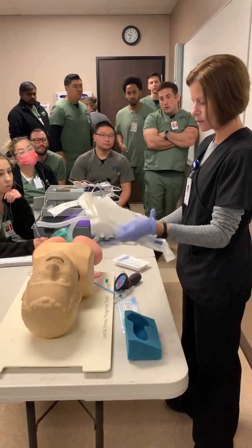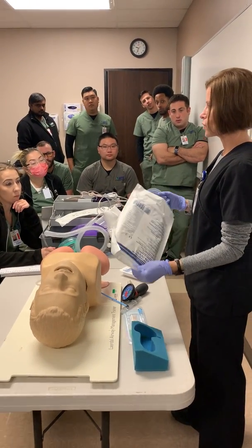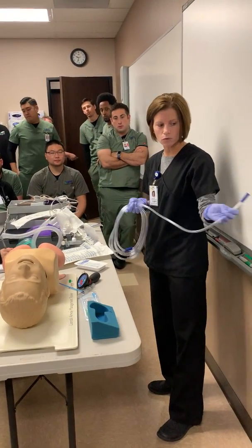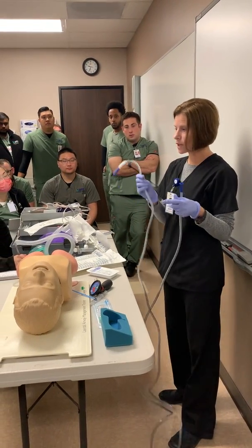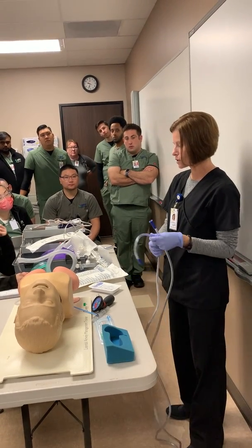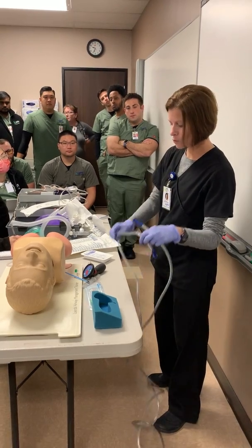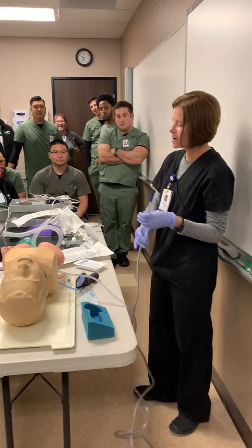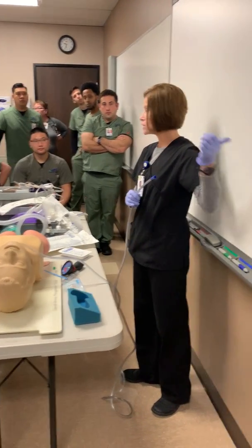So if I had this connected, have you all seen what a suction regulator looks like? Okay. So this piece is going to go, we'll imagine it goes here, and I'm going to have this end close to the patient. I kind of wrap it around the rail of the bed because I don't want it to fall on the floor, because once I have a sterile glove on, I can't get it dirty. So we'll pretend this is the rail, the guy's neck. And before you open this, once again, you want to make sure your suction is turned on.